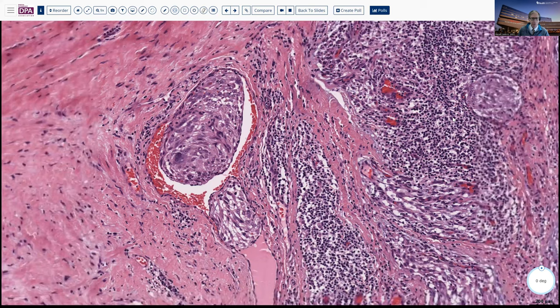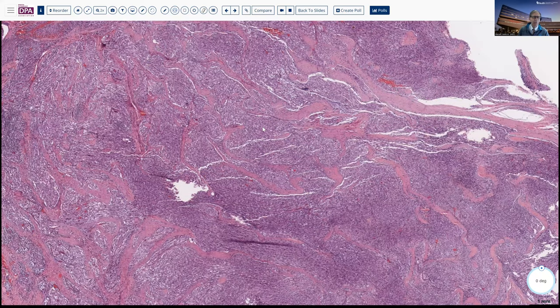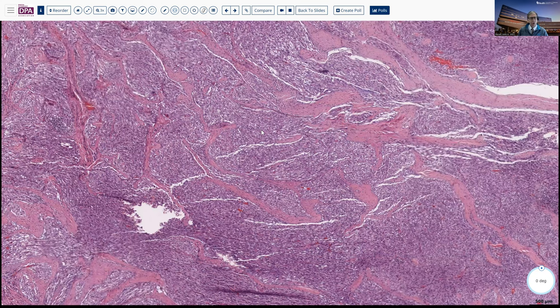Over the course of time, we did a number of immunohistochemical and histochemical evaluations on this lesion. The reticulin was not particularly remarkable for showing individual pericellular reticulin, but rather showed some groupings and nesting of the tumor. The tumor was beta-catenin positive, and of significance it was positive with both CD34 diffusely as well as CD31, particularly in these small vascular spaces, and also factor eight. So we thought perhaps this might be a vascular tumor.